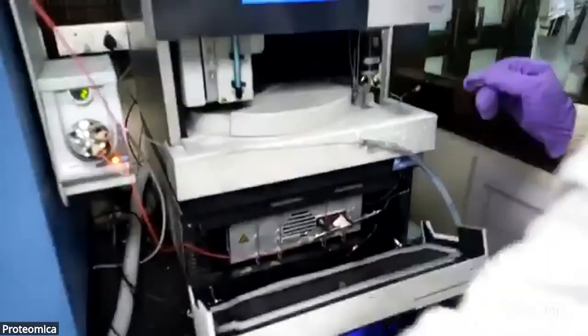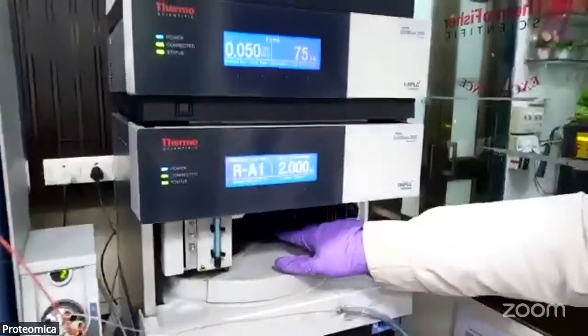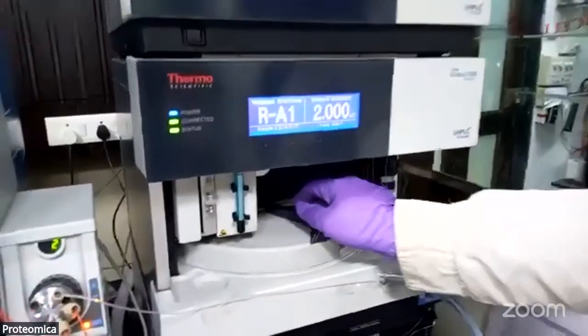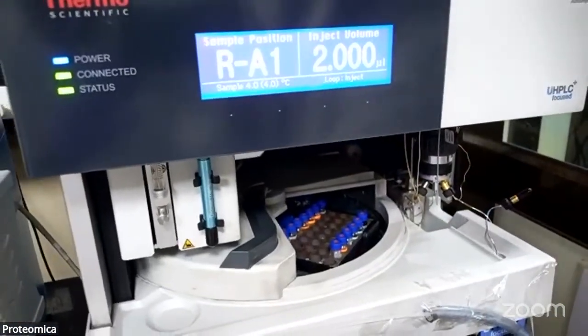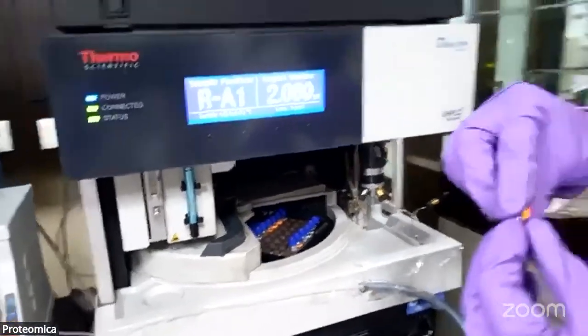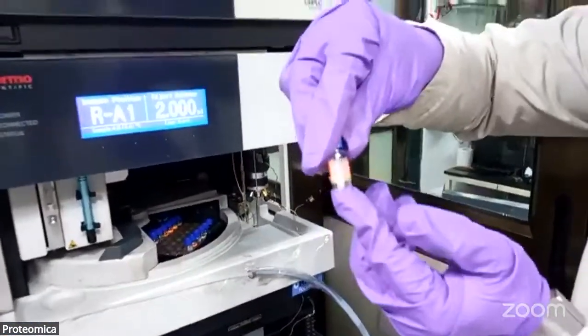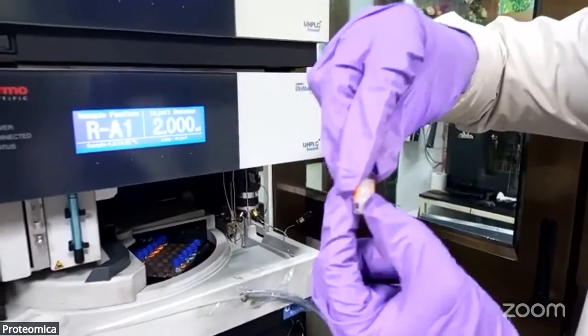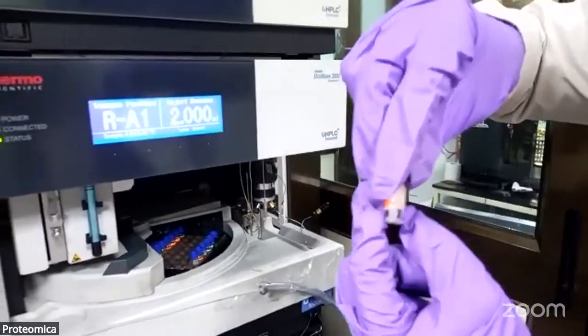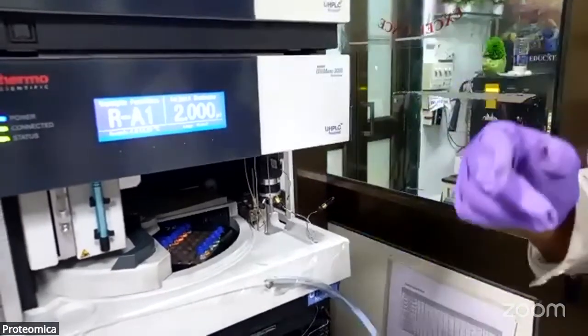Another compartment is the autosampler. In the autosampler, you basically need to put the samples here. In one run you can keep 120 samples. These are the different transparent vials you can see. There is also another component called the insert. In the insert you need to put your samples for further acquisition.